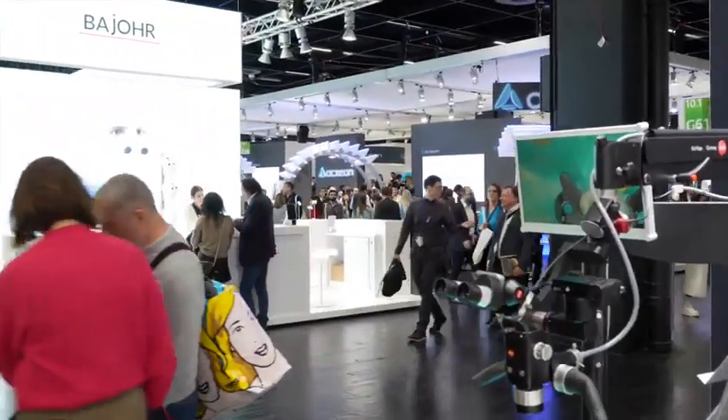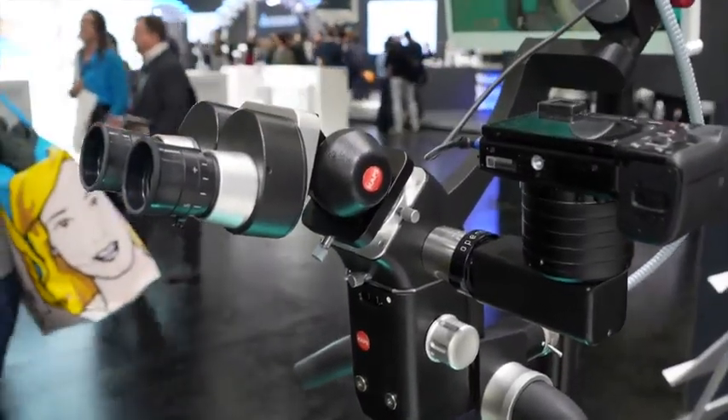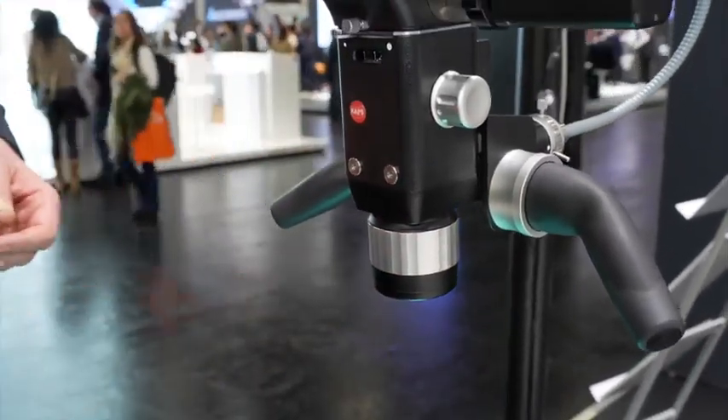Additionally, we have put our VARIFLEX objective into the Black Edition, which allows you to adjust the focal length from 200 to 350 millimeters so that you always stay focused.